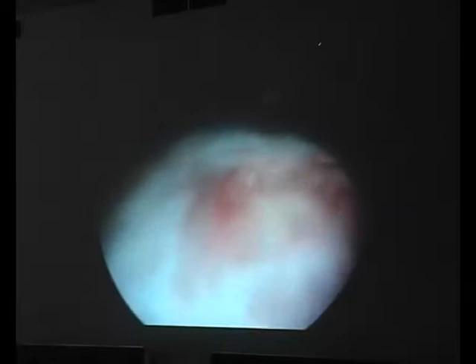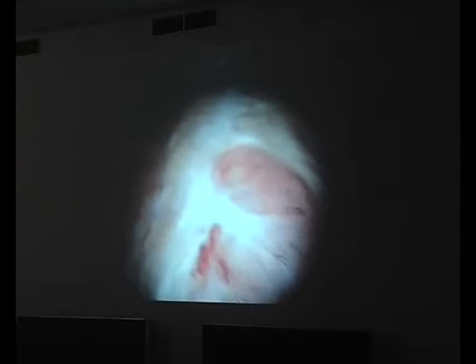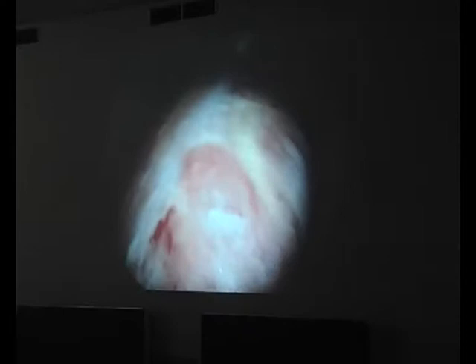And we see a left displaced abomasum. We go cranial, see the spleen, the diaphragm. Sometimes you have a contraction of the rumen. But you see that we have partially released gas, but the hole in the abomasum is closed and it does not sink down completely. Yeah, you can do it with a rumen contraction.